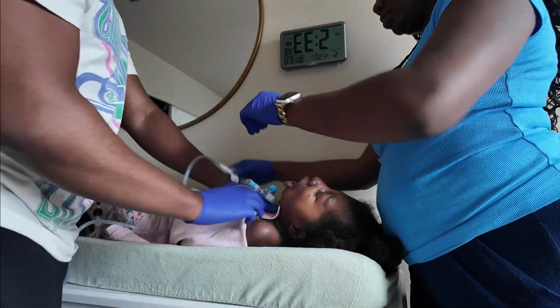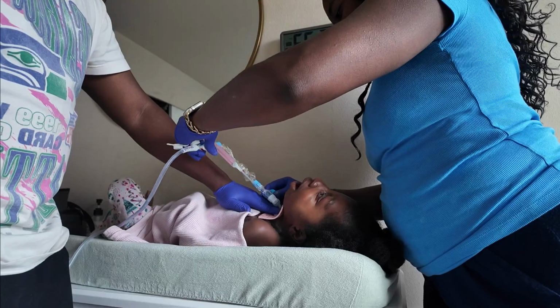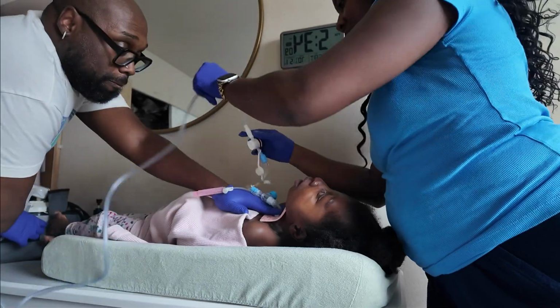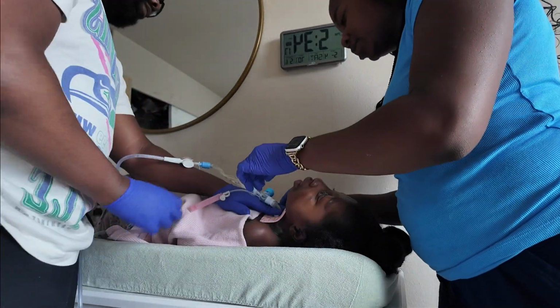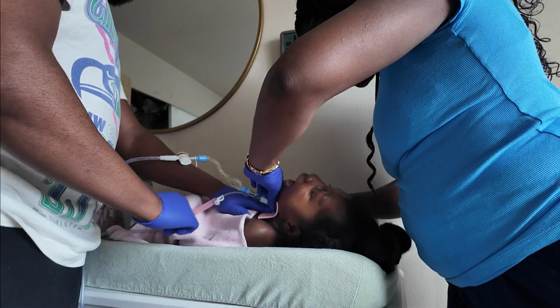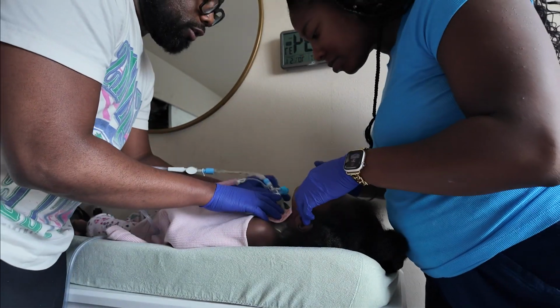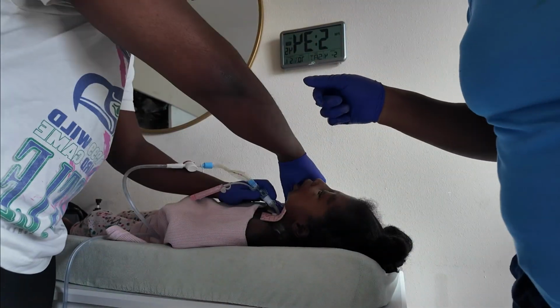We like to stop for a second and give her a chance to breathe and a break. It's not uncomfortable for her. Sometimes it tickles because we're getting in that neck area and we just give her breaks. We talk her through it. I'll tell her she's doing a great job. We'll remain calm throughout the whole process. We smile and we want her to know that it's serious, that we can't have her moving around. But for her, it's just an everyday thing that we do and it's part of her routine. And so she's become accustomed to it.